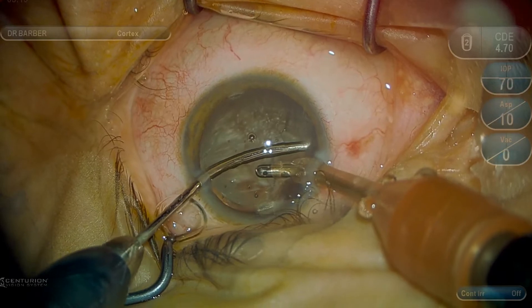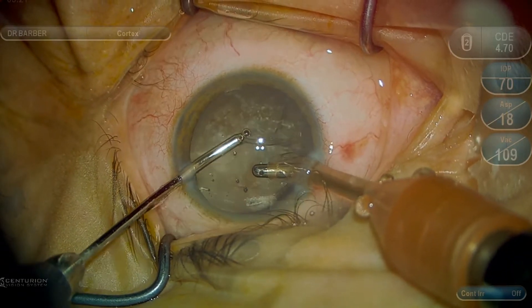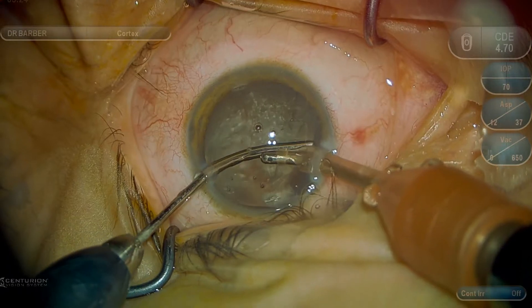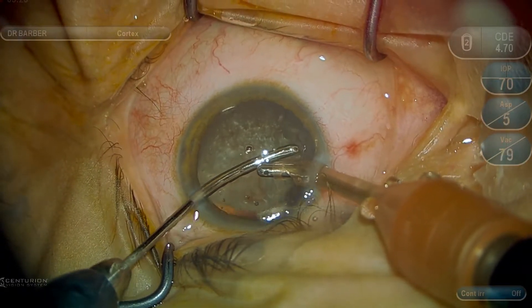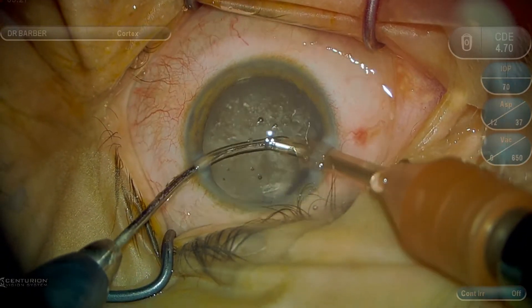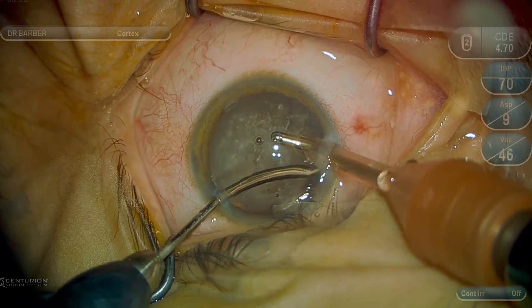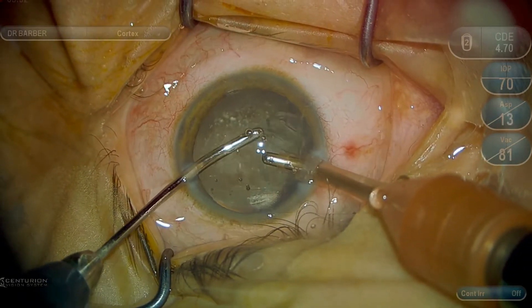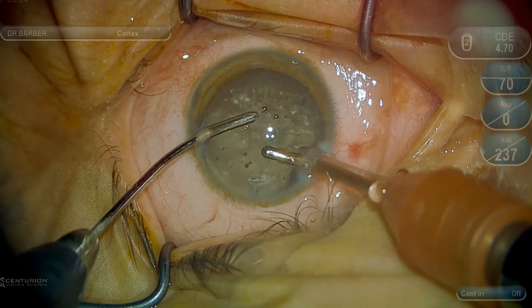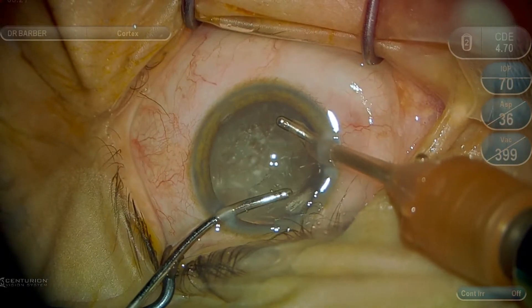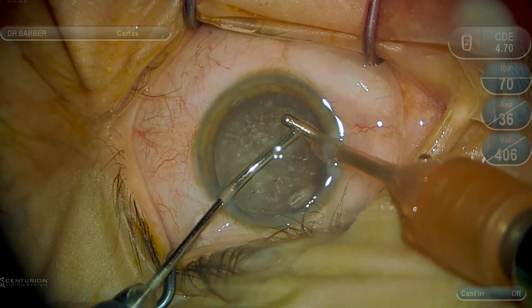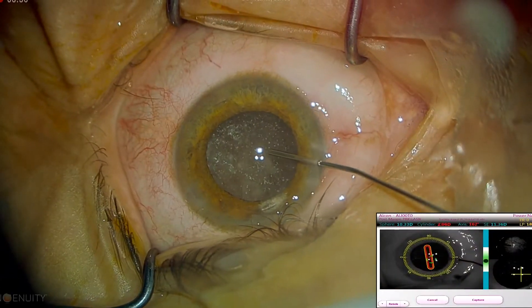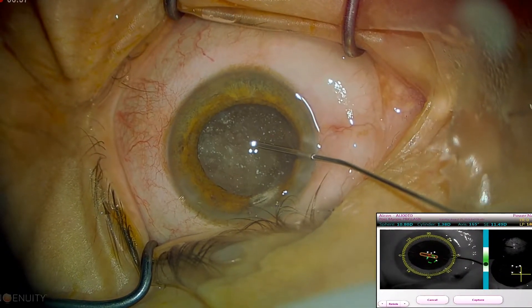The normal appearance of the posterior capsule is absent in this case because of the asteroid hyalosis. Therefore, we cannot rely on the normal visual clues. Using proper z-focus with the microscope and possibly converting to slower and lower settings on the phacoemulsification machine can make a case such as this safer.